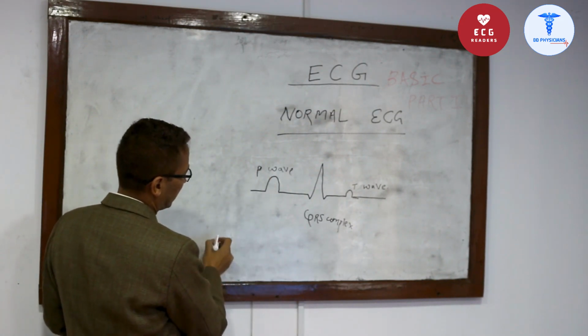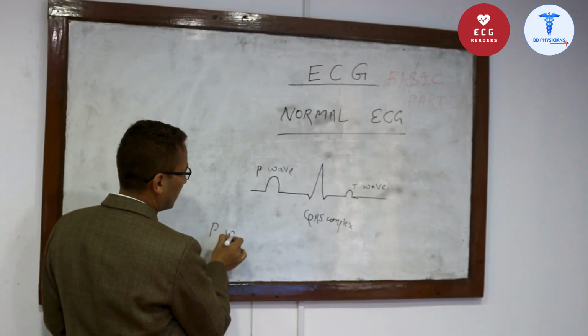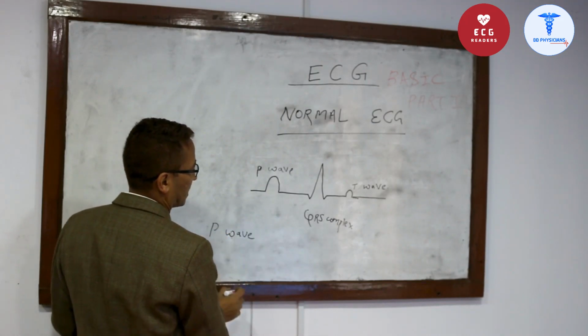The P wave represents atrial depolarization.